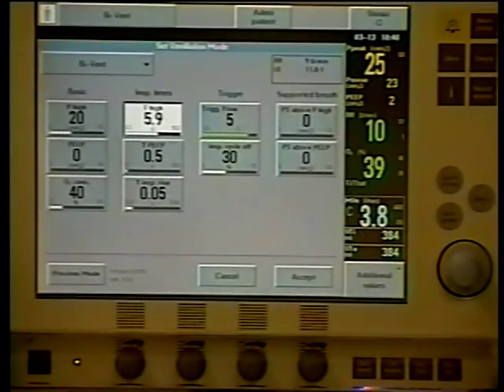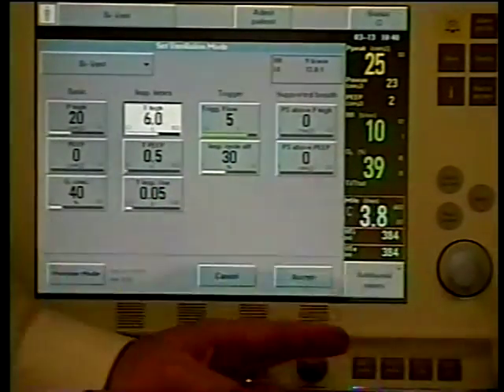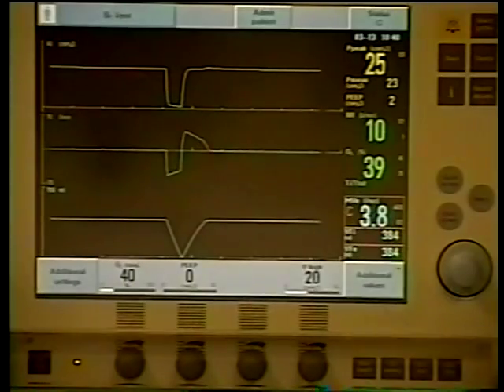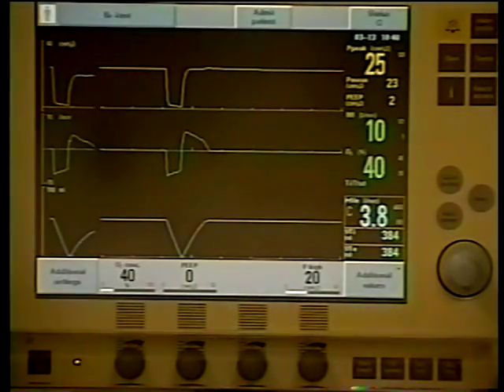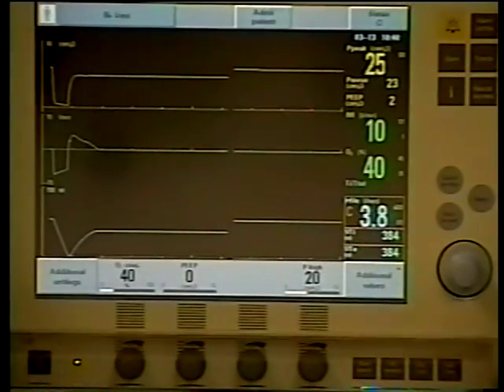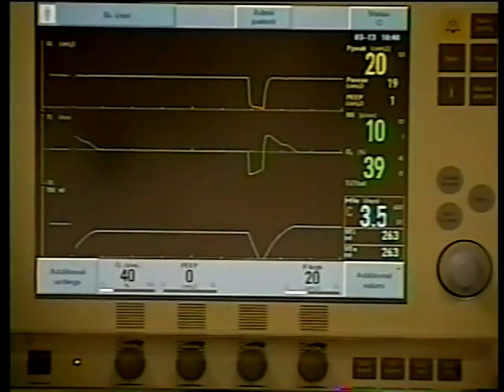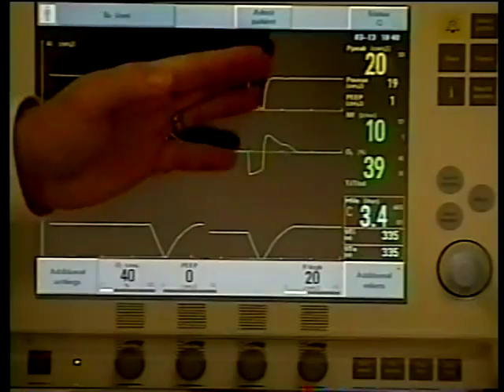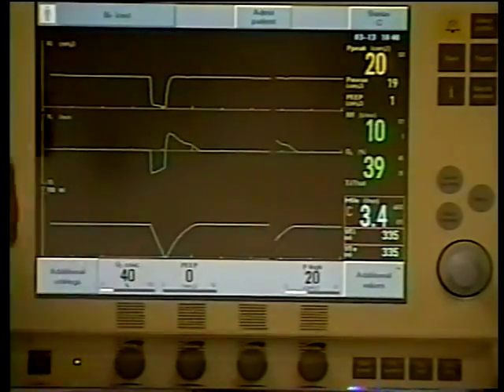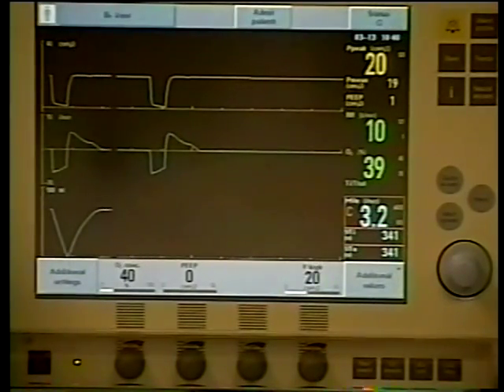Because as the patient improves, hopefully, they're going to be spontaneously breathing more and more. So I can start stretching this patient out. And one of my biggest watermarks, if you will, is if I'm going to switch a patient to conventional, and you can extubate from bivent. Most children's hospitals, I'm just going to be honest, don't follow that path. But if you're going to switch a patient to conventional, it's probably a good idea to at least have that mean airway pressure in the teens.